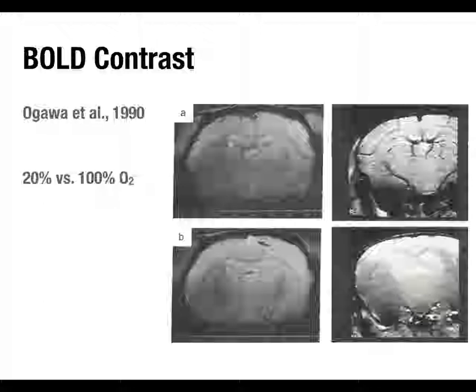It's not really actually a better signal-to-noise ratio. I think you're on to something, but that's not quite the right answer. Like Christina? More like veins in the top versus the bottom. You can see a better picture. Right, and you see them as what? Dark lines, right, exactly.